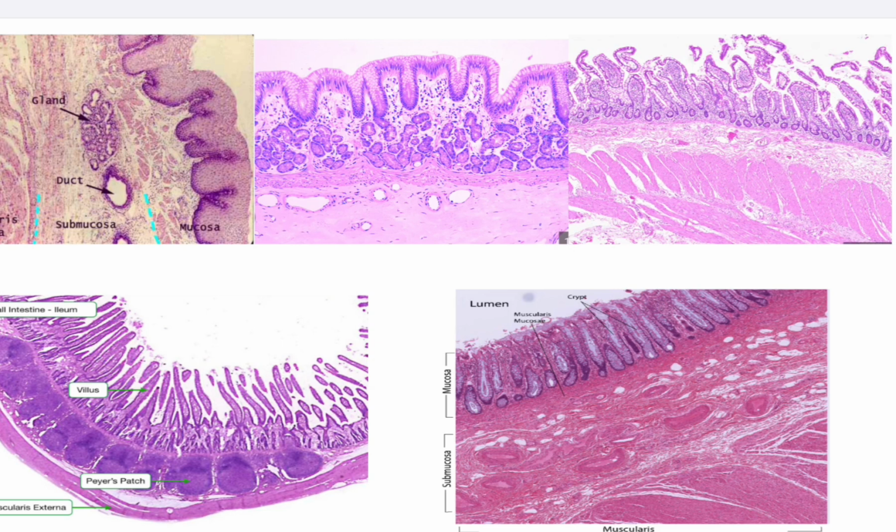Here we have shown some glands in the submucosa, and the epithelium is definitely stratified squamous because it has got a deep purple layer at the bottom with stunted ridges, and also there will be multiple layers of cells all along the epithelium. So that's esophagus.